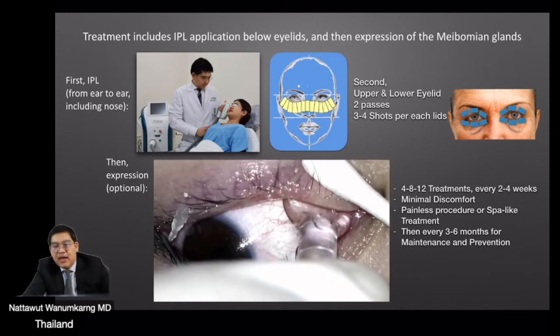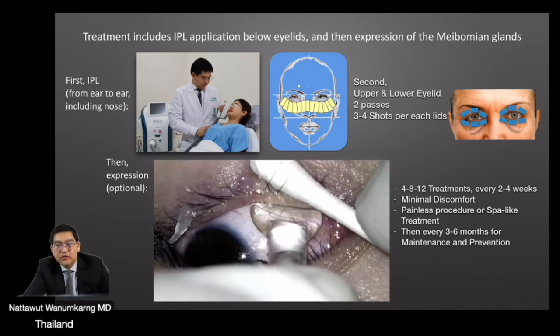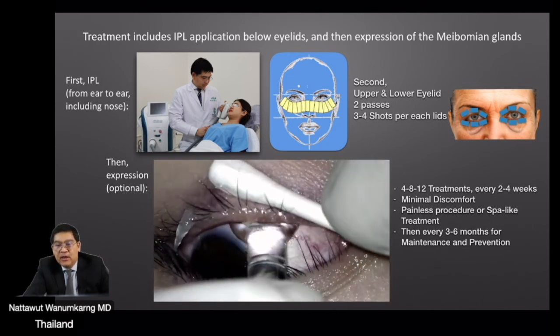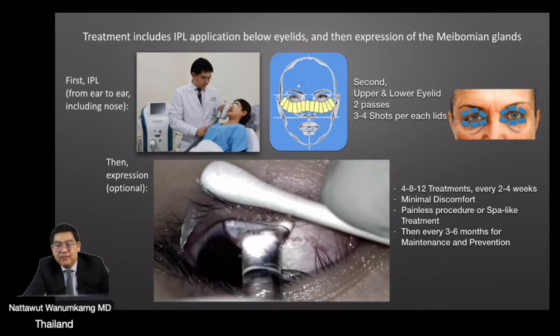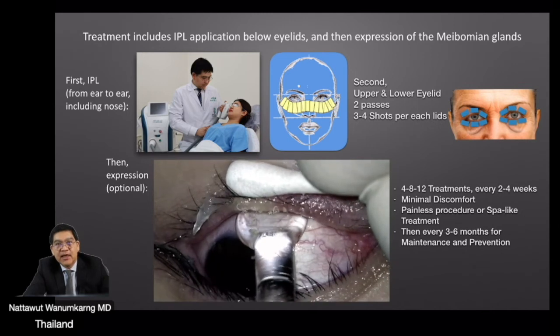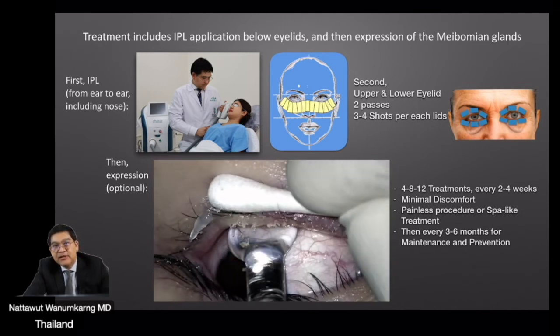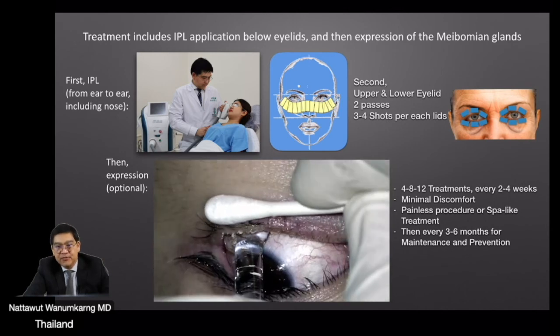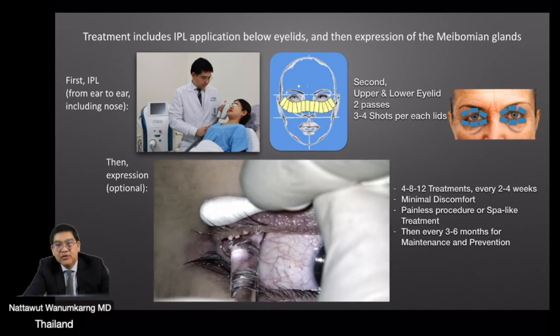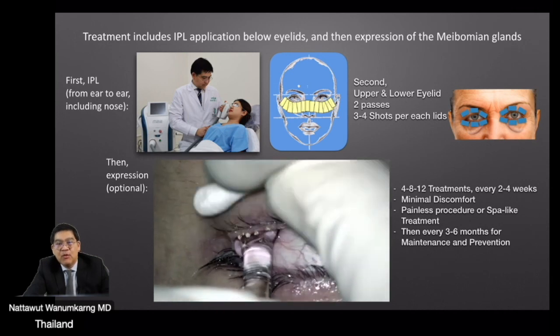For the IPL, we can start with 4 treatments, 8 treatments, or 12 treatments or more, every 2 to 4 weeks. It is a minimal discomfort, painless procedure, or spa-like treatment. Then, after achieving 80 to 90% improvement, every 3 months or 6 months a maintenance and prevention protocol would be recommended.